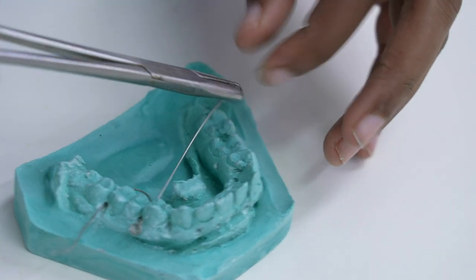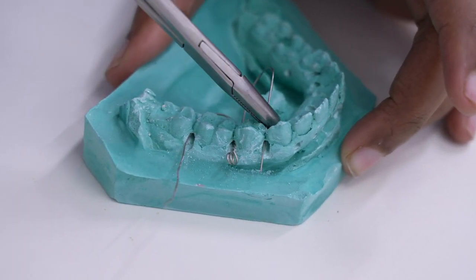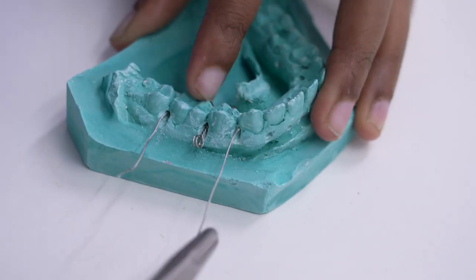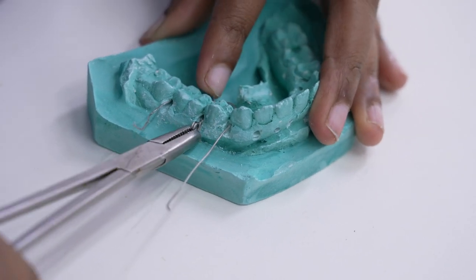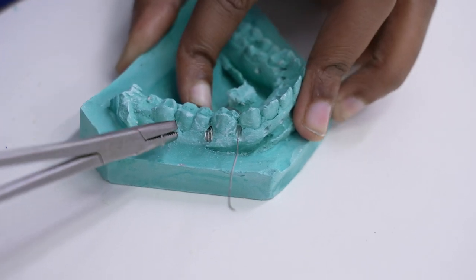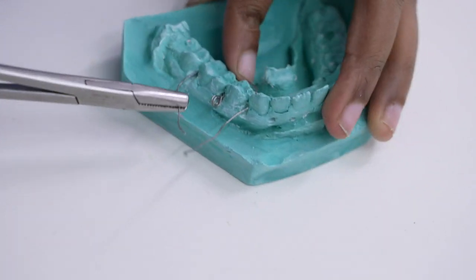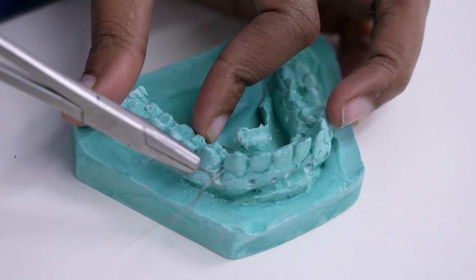Now I am going to wind it around the mesial tooth and pull it out. You have to make sure that your IV loop is well inserted and completely wound around each tooth. Then take the distal part of the wire — it goes from distal to mesial.